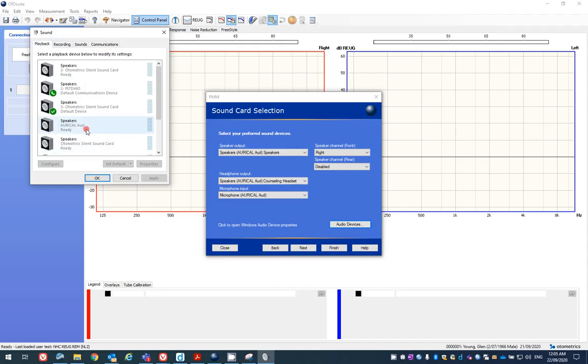So we can see some other things wrong, and that we've got these green ticks which indicate that these are default devices for something. So what we've got is, we can see that there's the Otometrics Silent Sound Card selected or Aurical Aud speakers. It's important that we have these not selected as default devices. So if we scroll down, we can find our Realtek device. So we've got our Realtek USB speakers there.